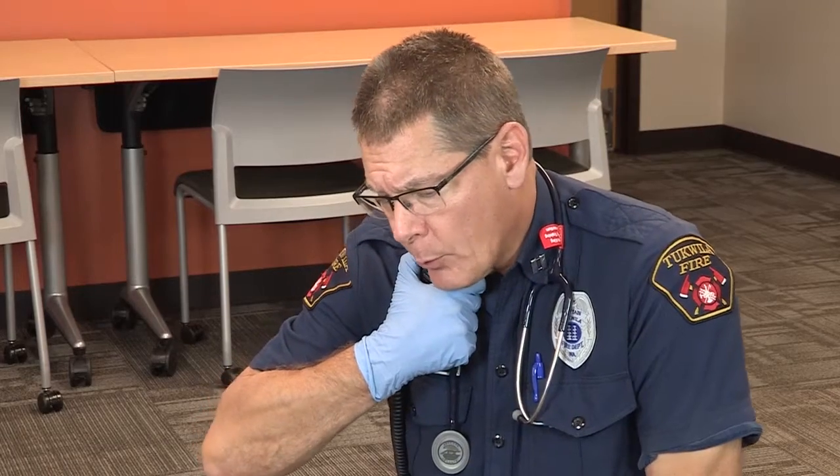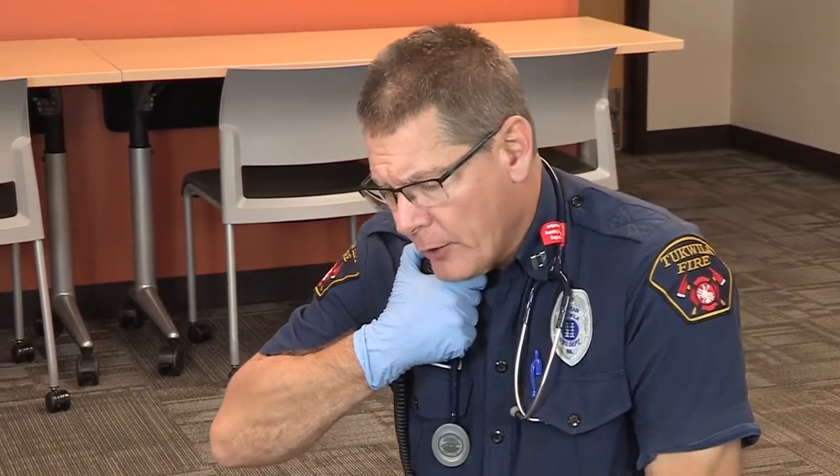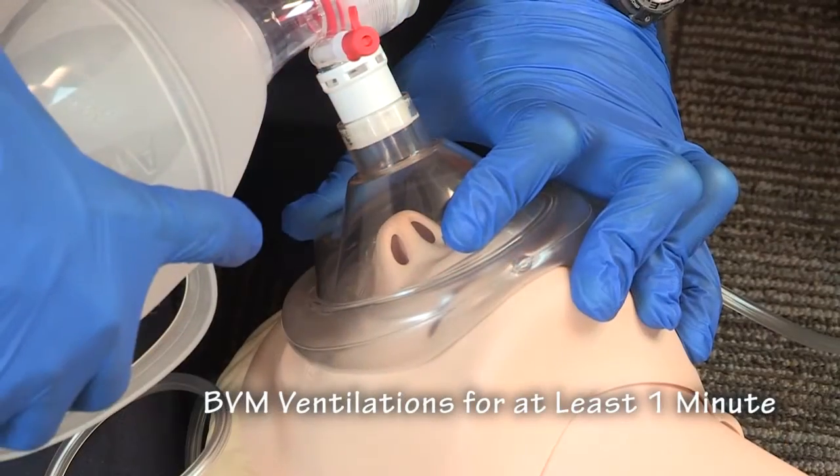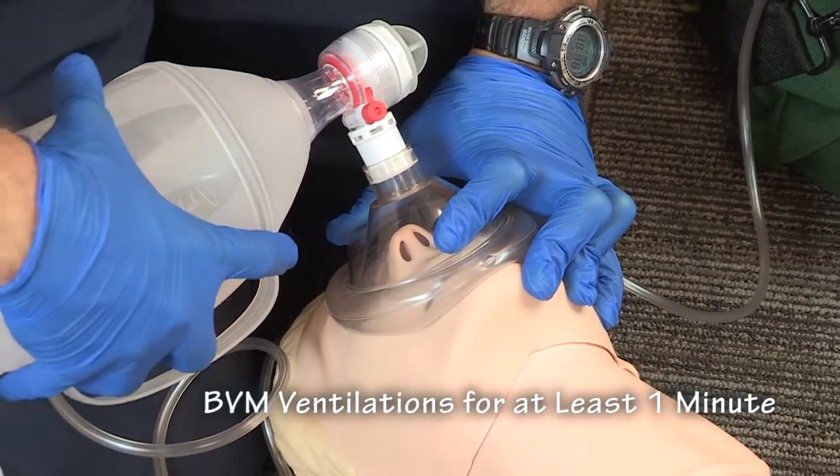Request one more unit plus a medic unit — we have a patient in respiratory distress. Ventilations using the bag valve mask need to occur for at least one minute prior to the administration of nasal Narcan.